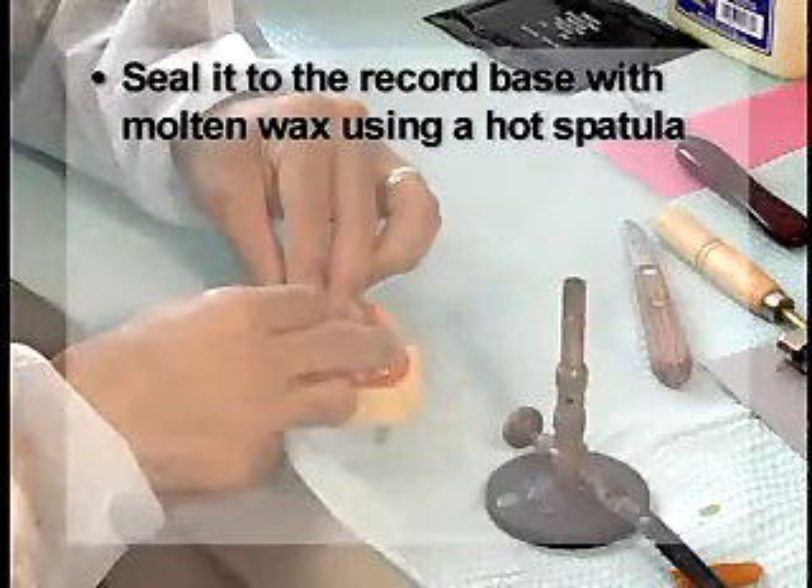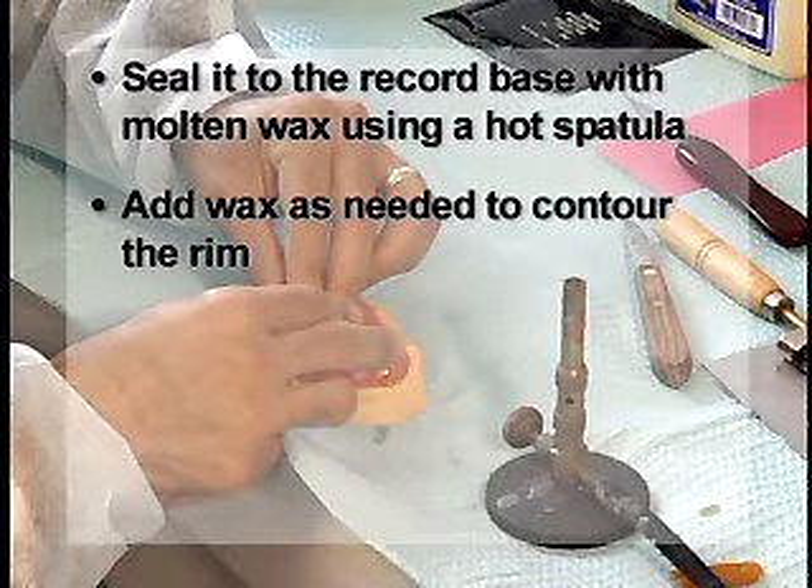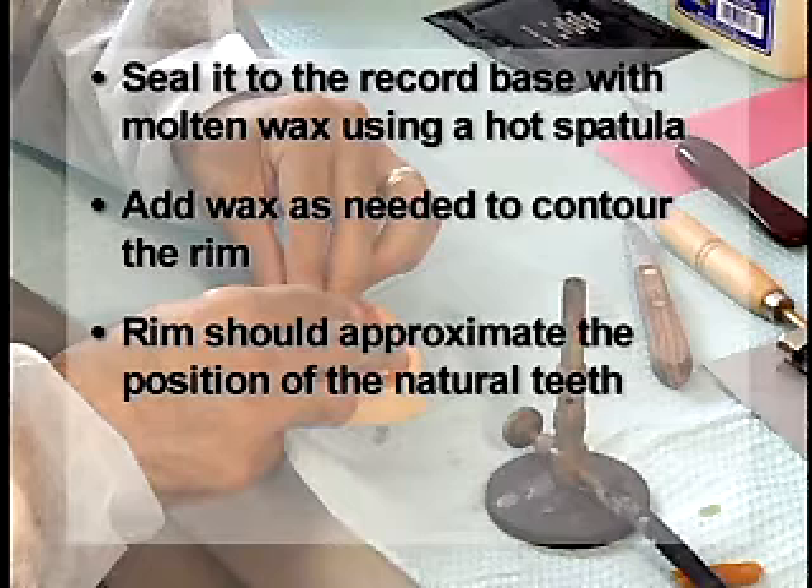Seal it to the record base with molten wax using a hot spatula. Add wax as needed to contour the rim. The rim should approximate the position of the natural teeth.